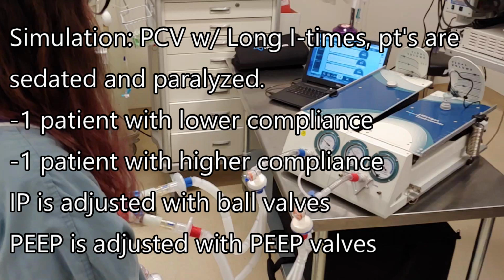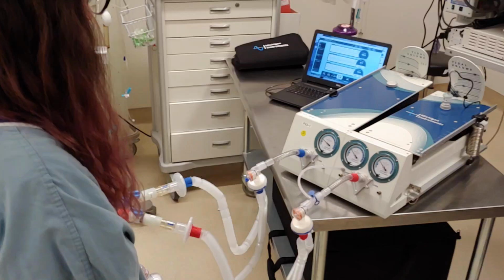One patient has lower compliance, one patient has higher compliance. Inspiratory pressure is adjusted with the ball valves on the inspiratory side, and our PEEP is adjusted with the external adjustable PEEP valves. So let's listen to Dr. Merritt, one of the anesthesiologists, explain what we have going on here.